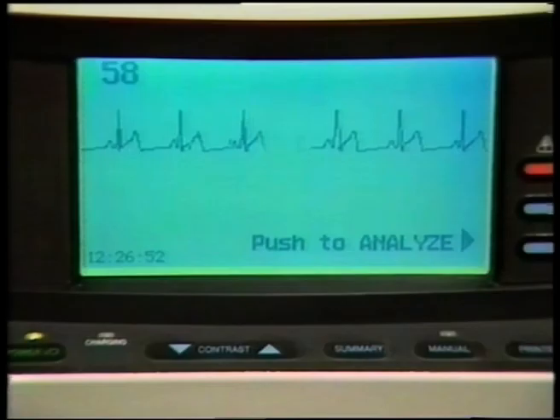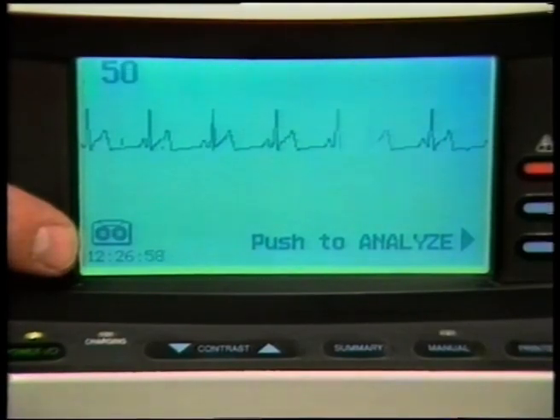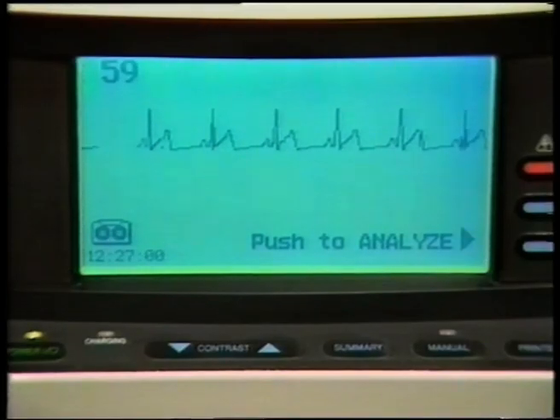Status of the cassette tape is monitored continuously by the LIFEPAK 300. The message "Check tape" flashes twice if the cassette tape is missing, jammed, or if the tape has been fully recorded on one side. Simultaneously, a tape symbol appears in the lower left corner of the display. This display message will not affect device operation.